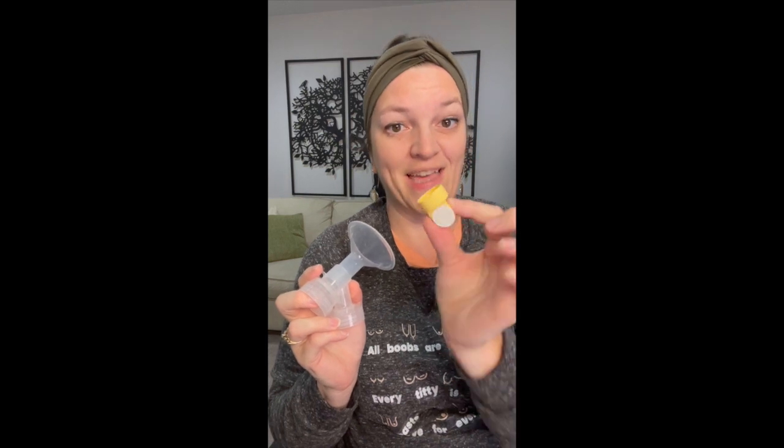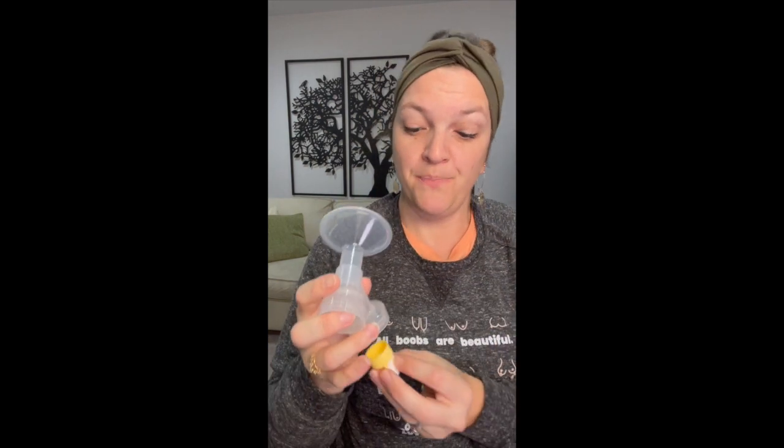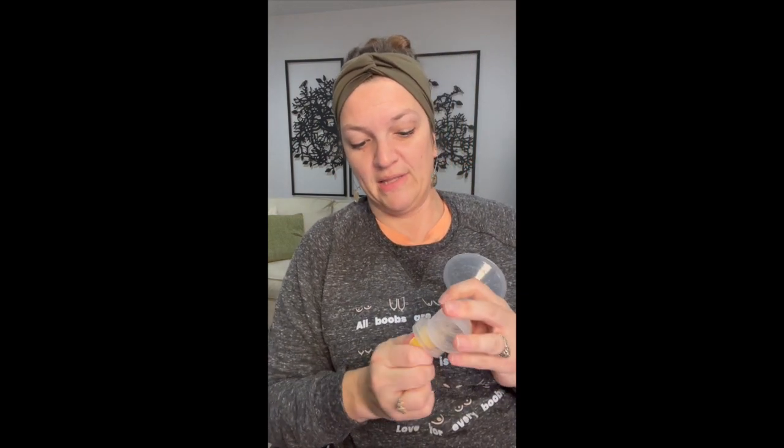Do you have a Medela pump like the Harmony hand pump or the old school pump and style that has this yellow piece with the white membrane? How you have this placed in your pump flange absolutely makes a difference in your pumping journey. You want to make sure that when you're pumping, it is actually facing the opposite breast. So when you're pumping on the right, you want it facing to the left. When you're pumping on the left, you want to make sure that it's facing to the right.